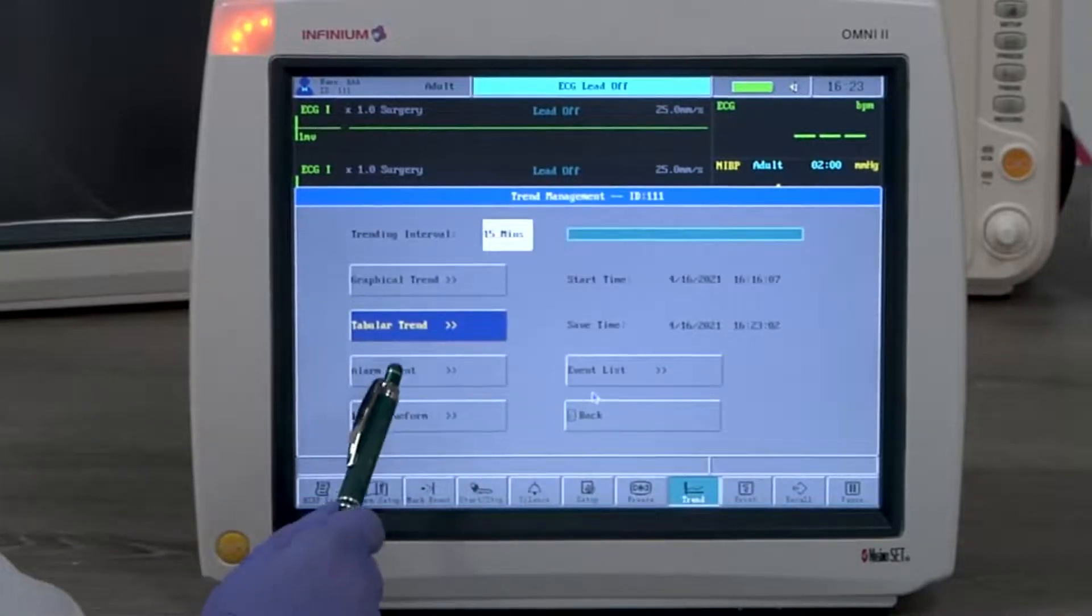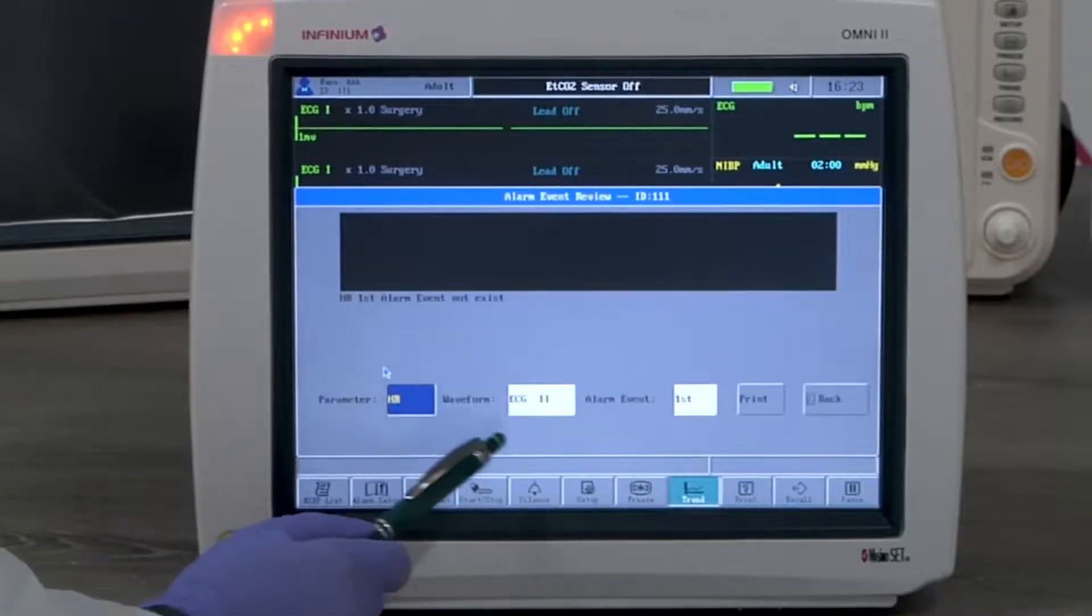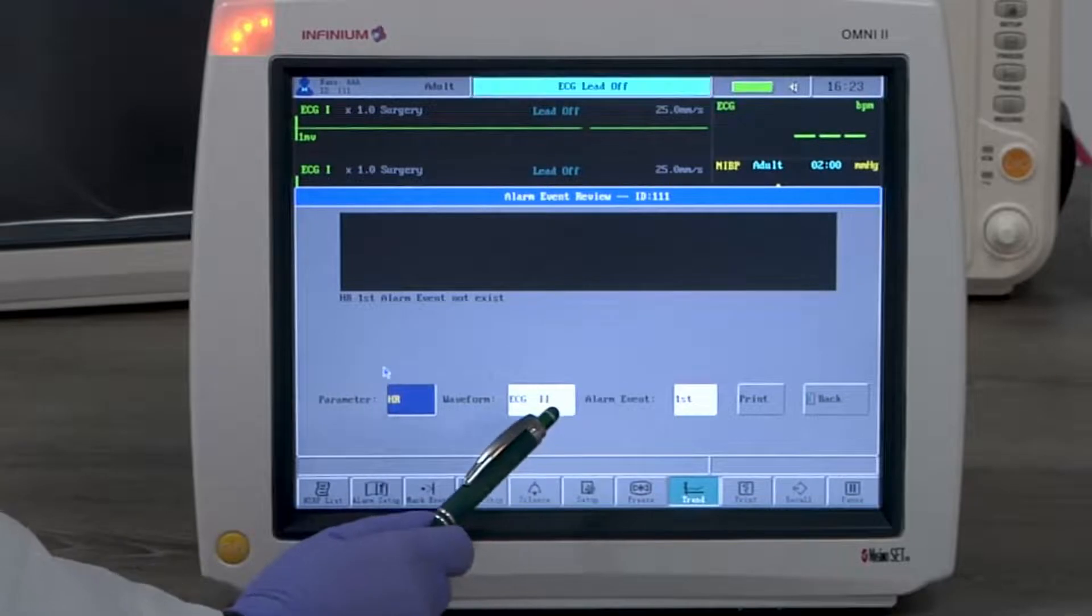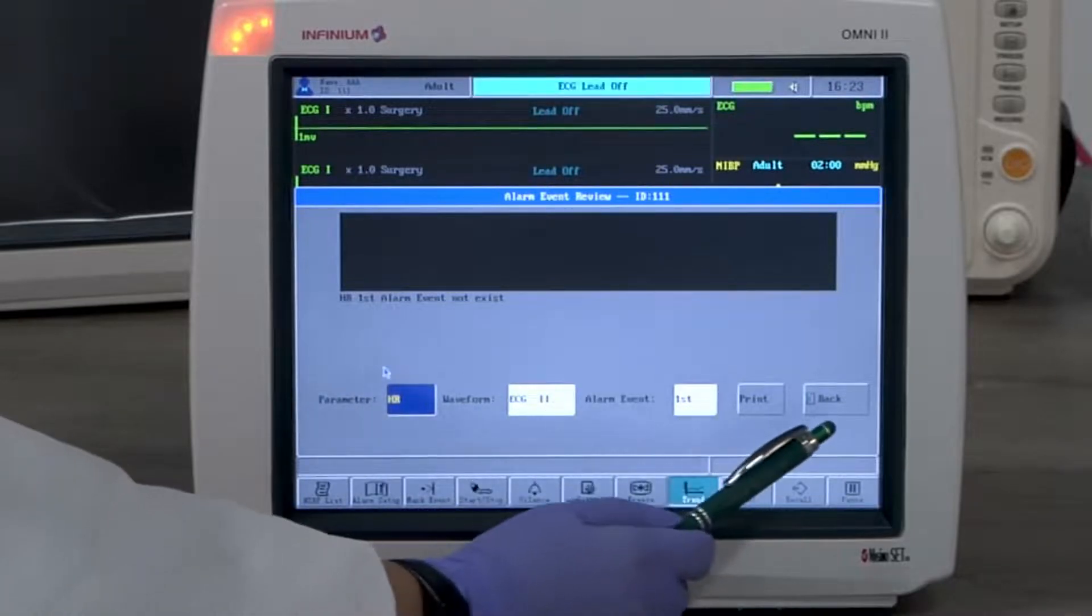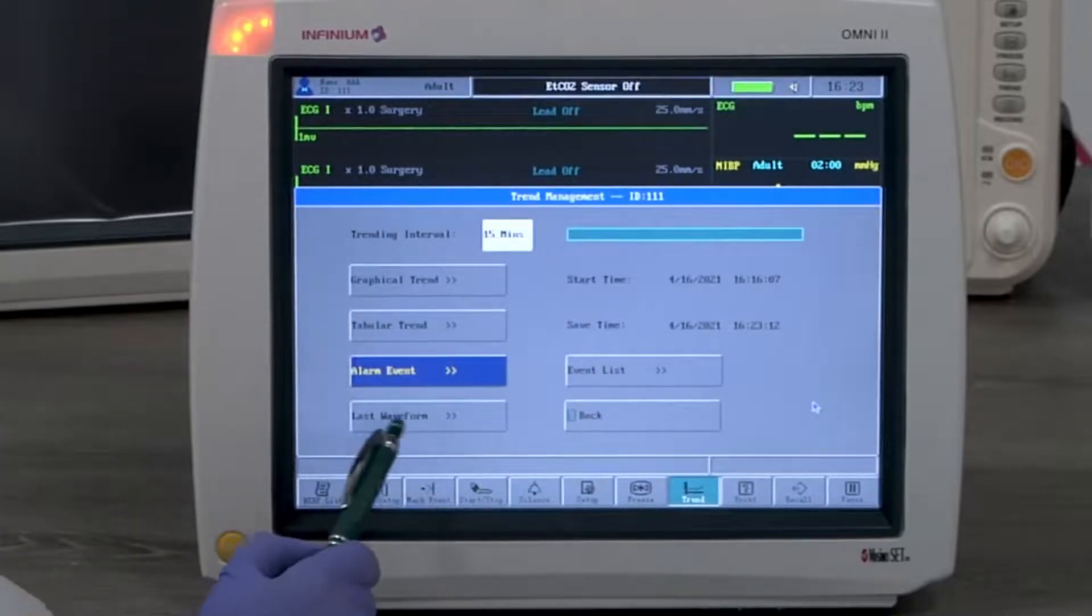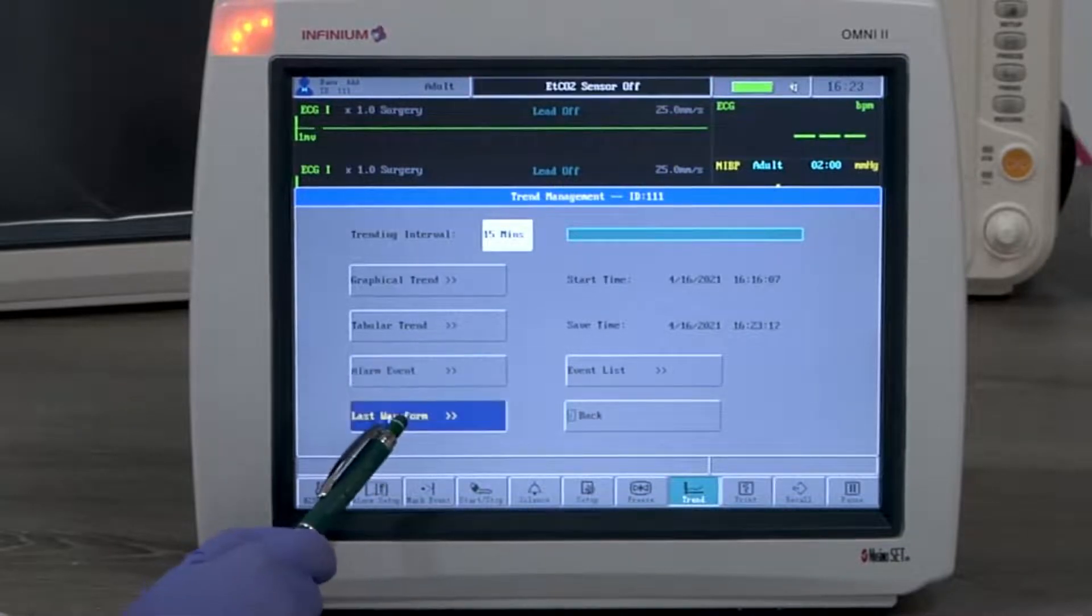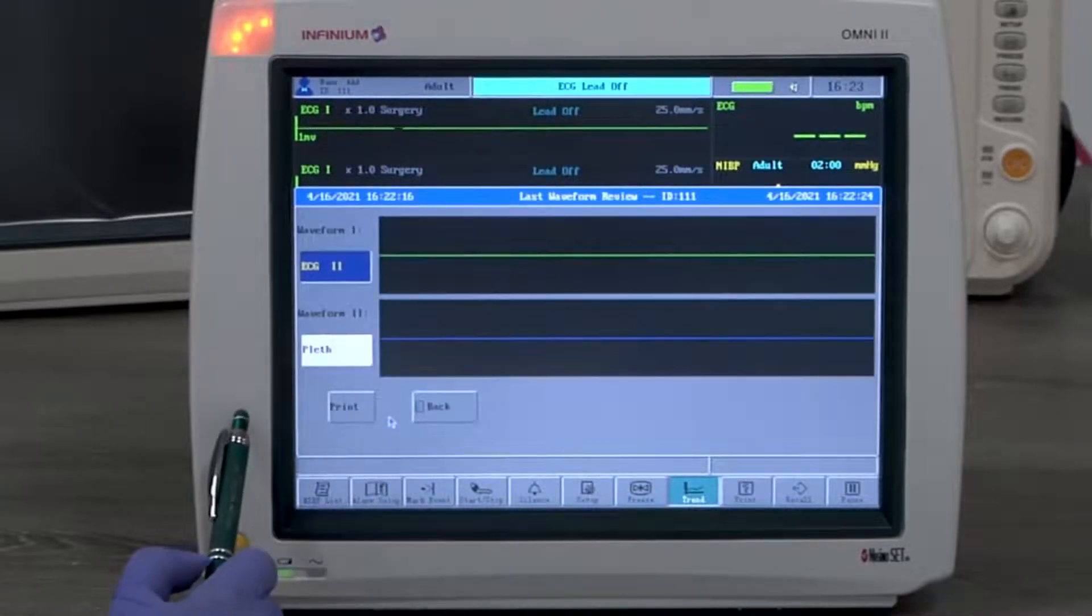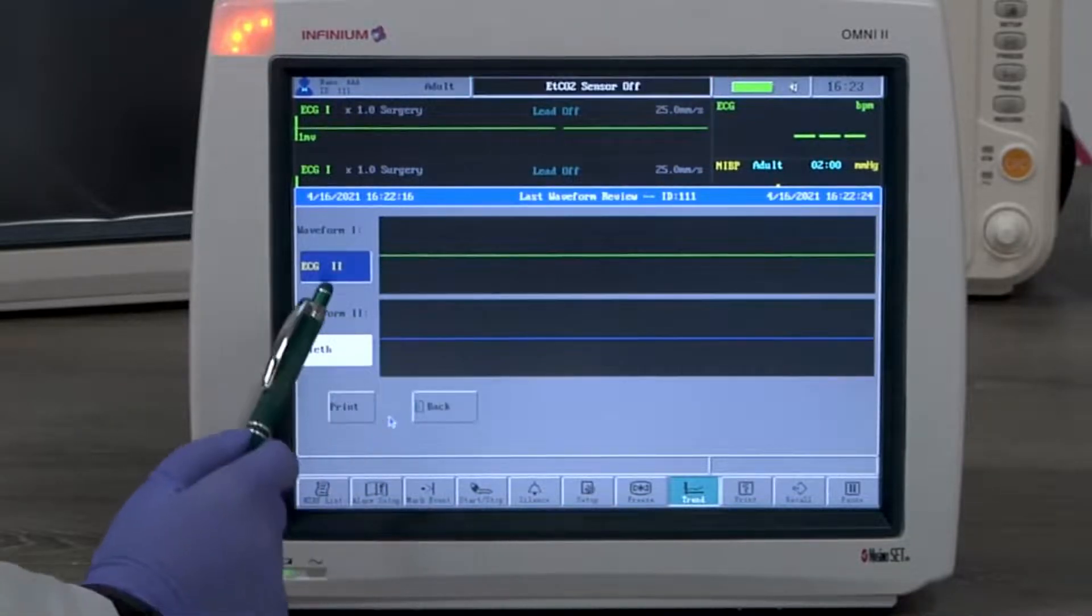Alarm event shows the history of alarms of the selected parameters and eight seconds of waveform at the moment of the alarm, if available. Last waveform shows the last eight seconds of the waveform of the selected parameter when entering trend management.